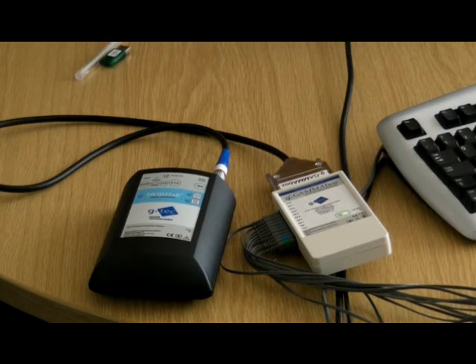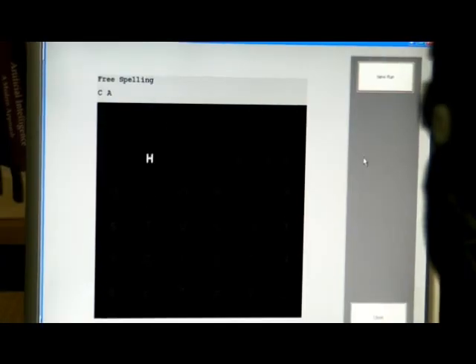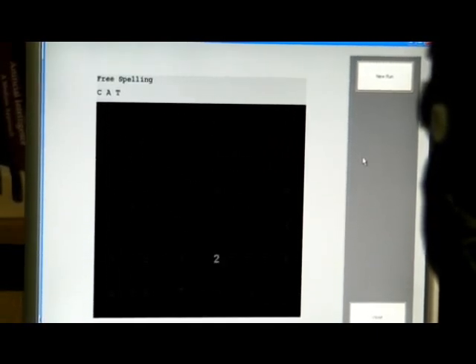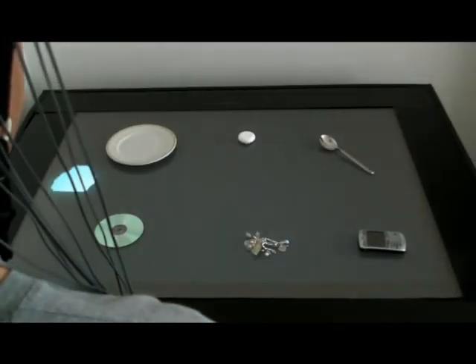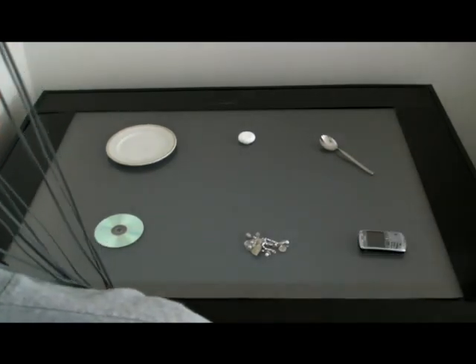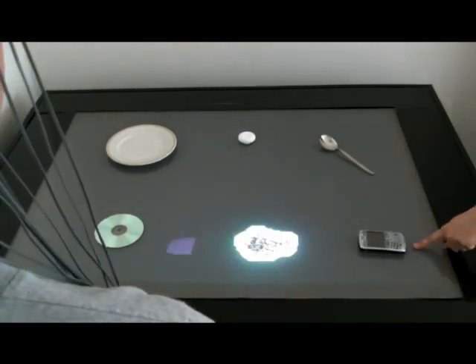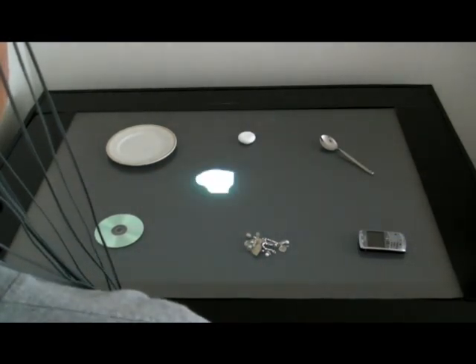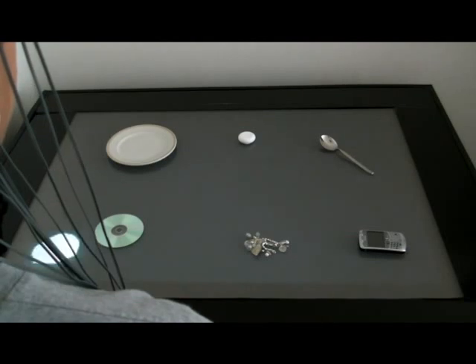Every time the target character or object flashes, and the user counts in their head, a P300 response in the user's brainwaves is evoked. The P300 waveform is an event-related potential which occurs around 300 milliseconds after the stimulus. Here, the user will be identifying the phone. The peak of the P300 waveform correlates with the object that was flashing 300 milliseconds before, so that the correct object can be identified.